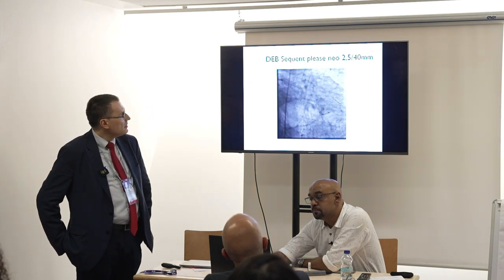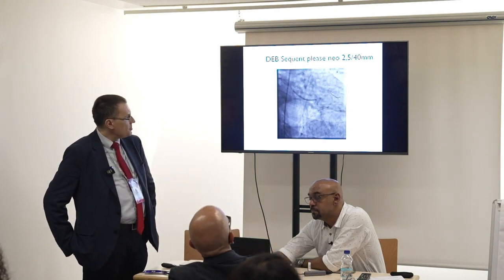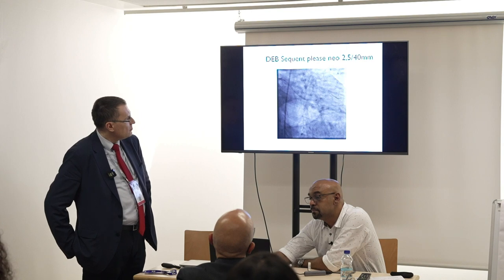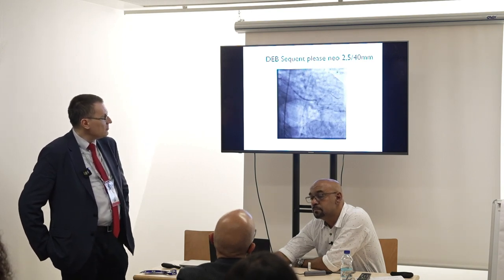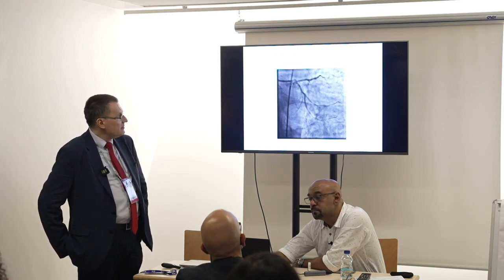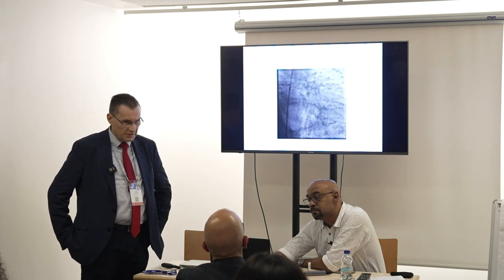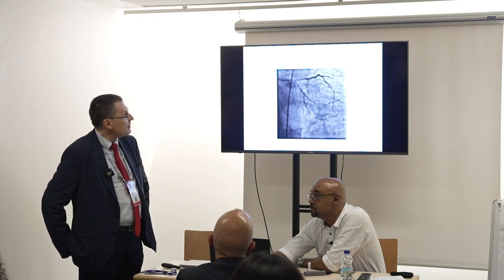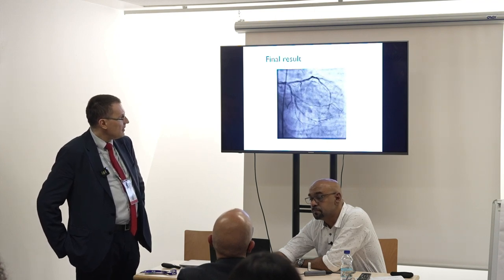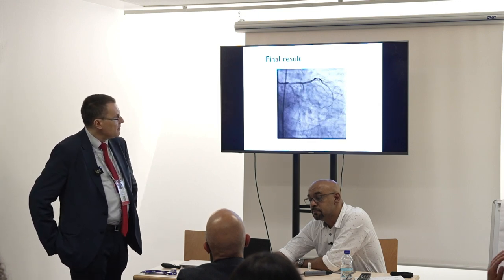And next, I used a long drug-coated balloon for fixing this marginal branch because it was quite difficult to cross, and I didn't imagine that I could be able to place a stent there. And moreover, this was maybe around 2.5 hours from starting the procedure, and the patient was pretty tired. But anyway, this is the final result. And this is how we finish without any evident dissection, without signs of ischemia.